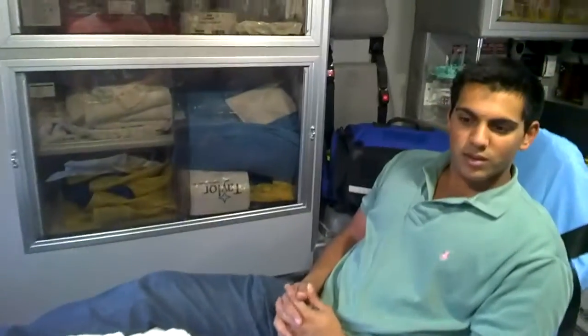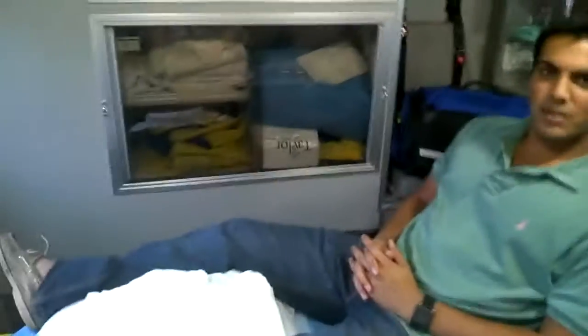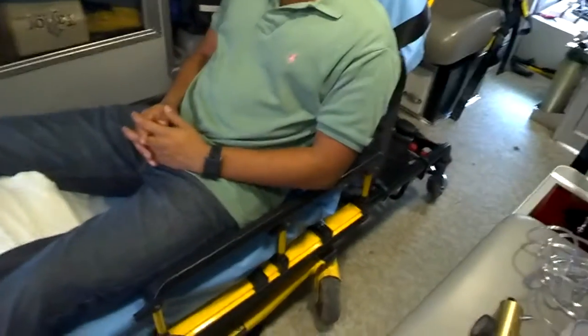Hi, my name is Davis Cho, and I will be demonstrating oxygen therapy, and we are in the SUA ambulance. Hi, my name is Alec, and I'm going to be the patient. Okay, so this is an oxygen, and we have different devices to give the oxygen to the patients.